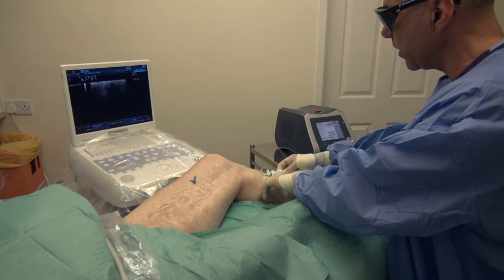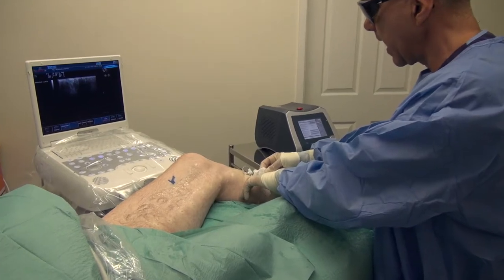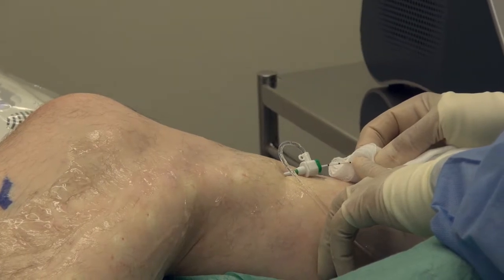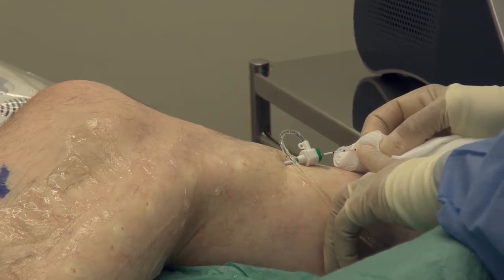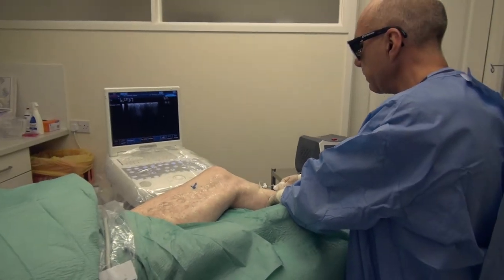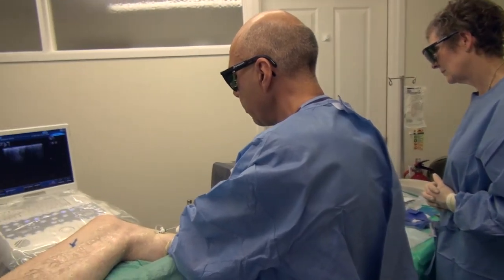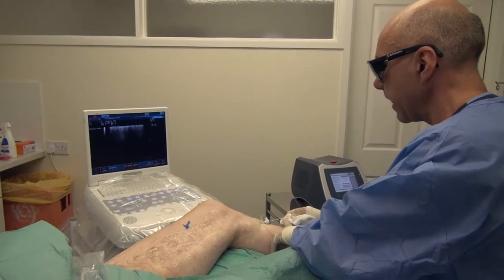The laser is delivering a certain amount of energy per second, measured in watts. In the background you may be able to hear a little musical note which indicates that the laser is in action, and it also has a metronome beat. Every five seconds there's a little 0.2-second pause, and that tells us there's a five-second marker. By withdrawing the catheter — which is marked in centimetres — at a certain rate in time with the metronome, I can be sure of delivering the correct amount of energy.